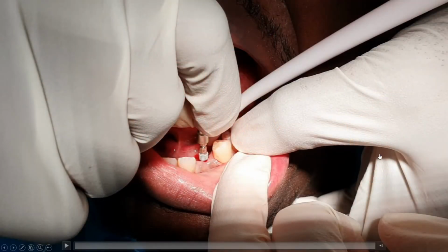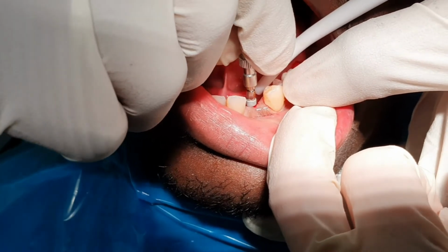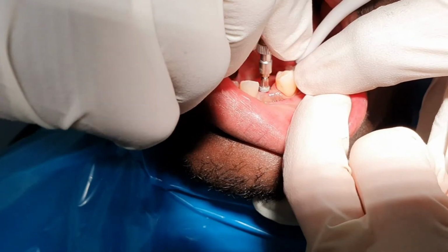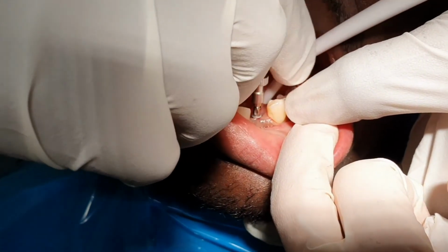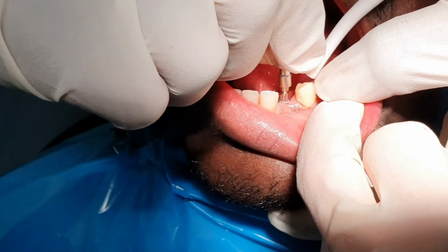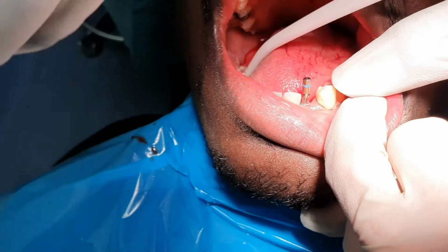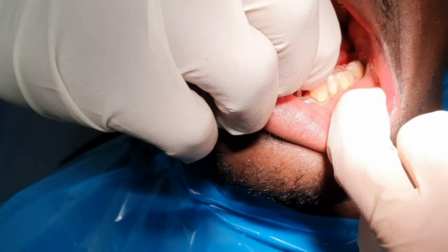And so you can see the thing being started now, and the surgeon can drive that back home and turning it round and positioning it down and just letting it find its own way down the osteotomy site. Obviously the template has been removed now to allow him to do this, and he carries on screwing it down. Now you'll notice as he screws it down it becomes less wobbly and more firm. You've got good primary fixation there, and now he is going to remove the carrier that comes in the packaging.